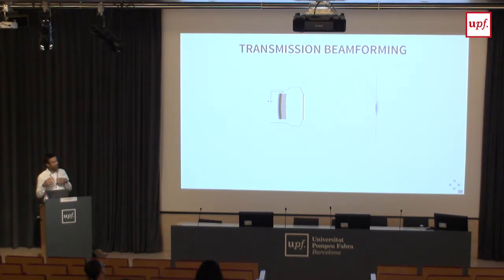delay pattern. So the wave is actually focused on one point at a certain depth. So you hopefully can see that the wave is converging here. And then by changing these delays, this wave can be made to converge deeper or even closer to the transducer.